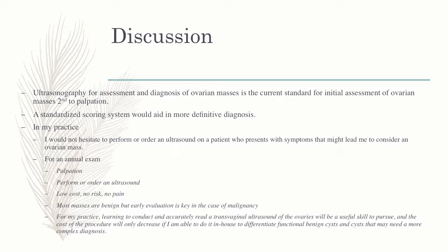So in my practice, I would not hesitate to perform or order an ultrasound on a patient who presents with symptoms that might lead me to consider an ovarian mass. So even for an annual exam, I'd palpate, perform, or order an ultrasound. The cost is low, the risk is minimal to none, and no pain. So especially since most masses are benign, but we can never really rule out that malignancy unless we take a look into it. We still want to do the test if we have any kind of suspicion.